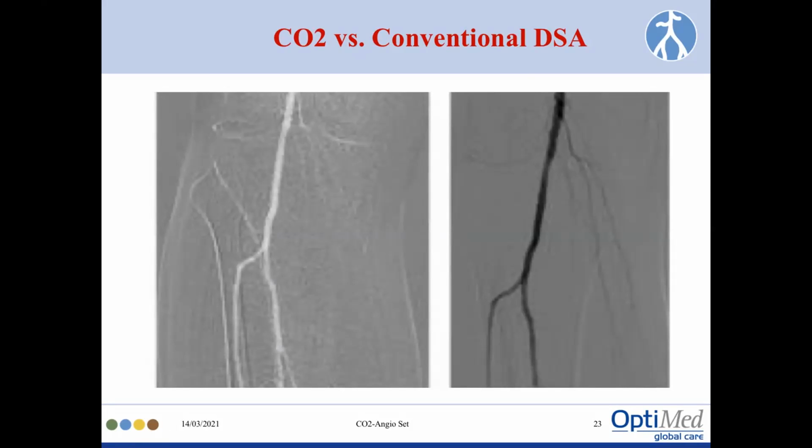And you can see here the same patient, same picture. If you put contrast on one side, on the right, and you see CO2, it's pretty much the same. So, for all those who would bias your mind saying that, oh, we have seen it all, it's useless. Well, if you're keen and you stick to it and you learn the trick, over a period of time, you will master it, and you can get as good pictures with the carbon dioxide as you would get with conventional contrast.